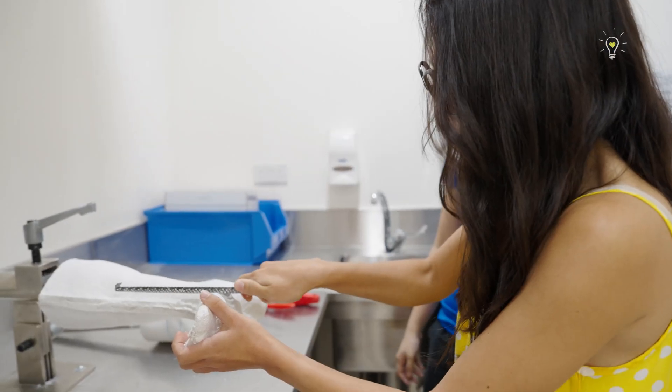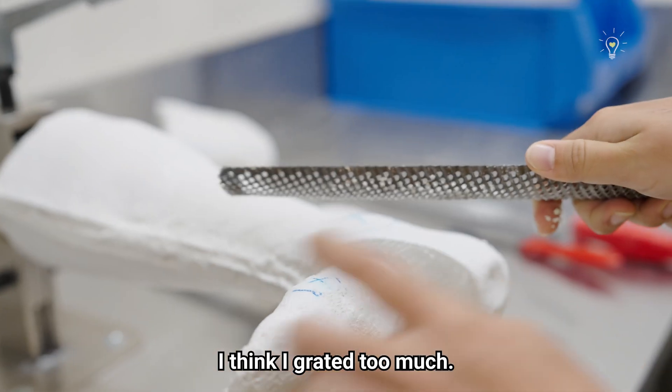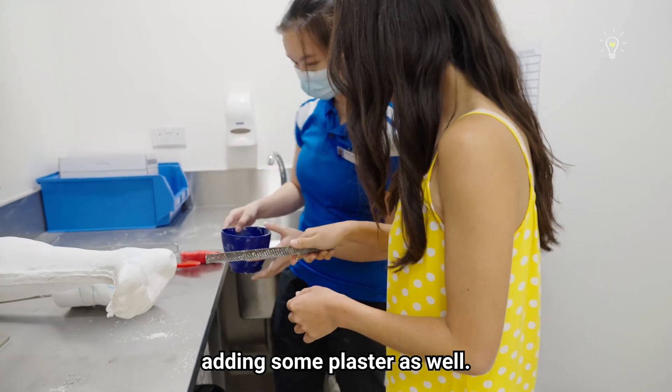You want to try? It's like grating cheese! Yeah, exactly. Look at that — I think I grated too much. It's okay. Then we can practice adding some plaster as well.